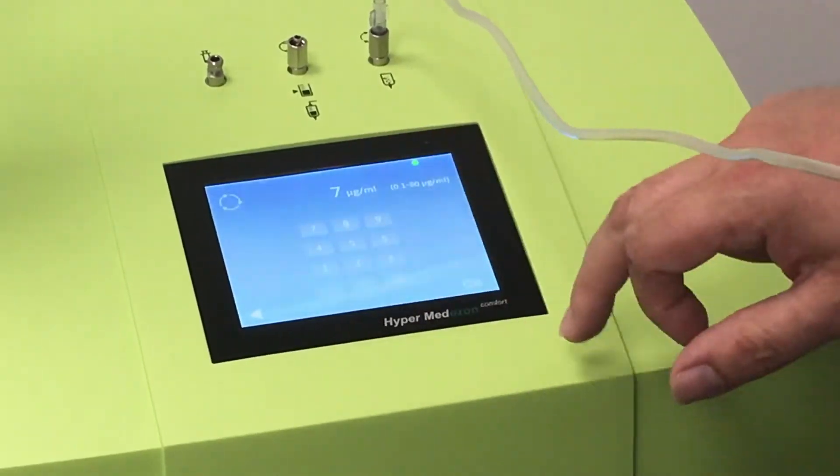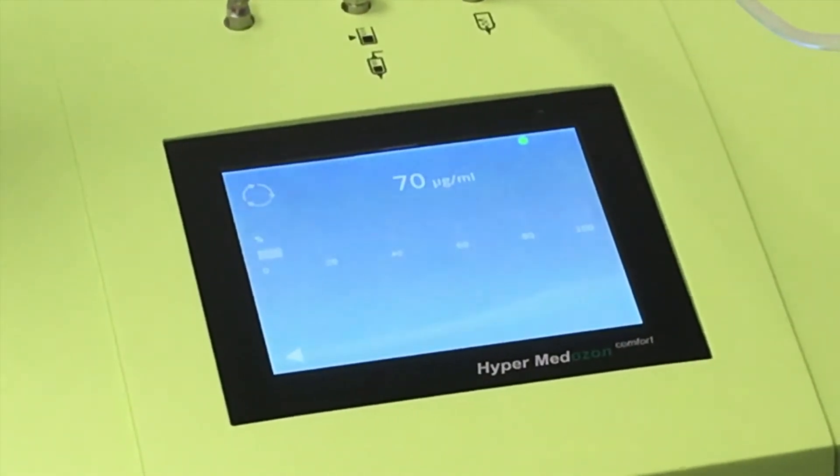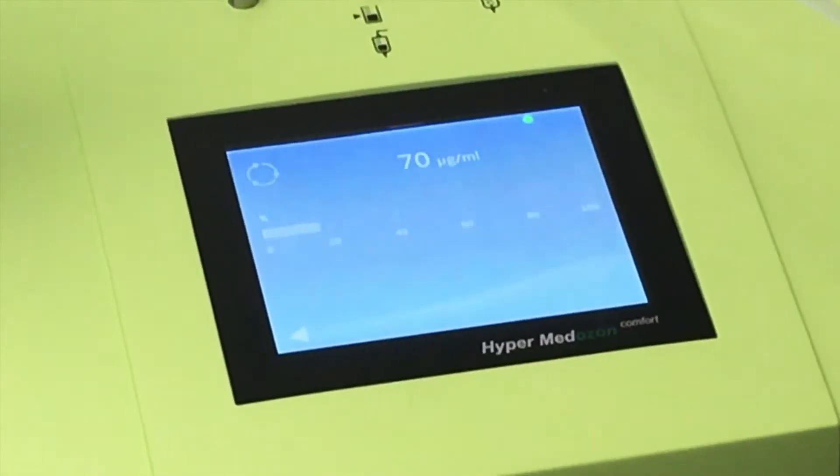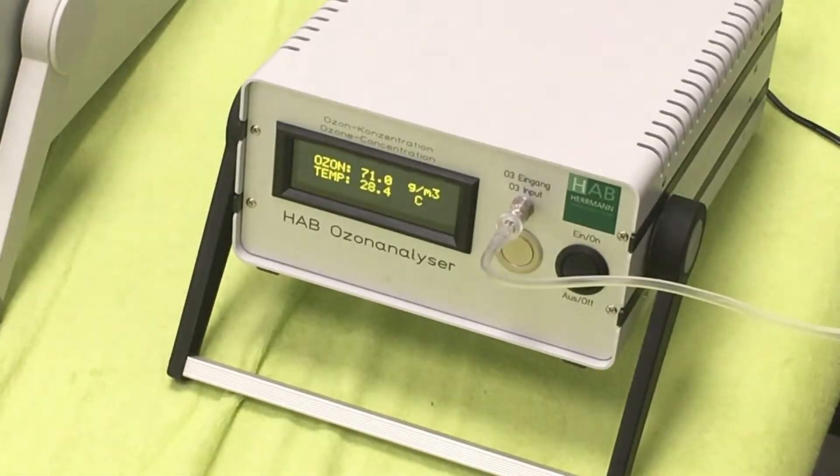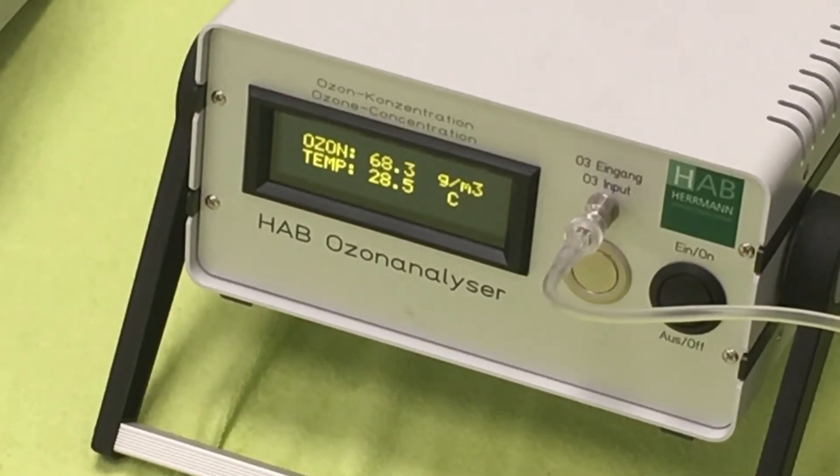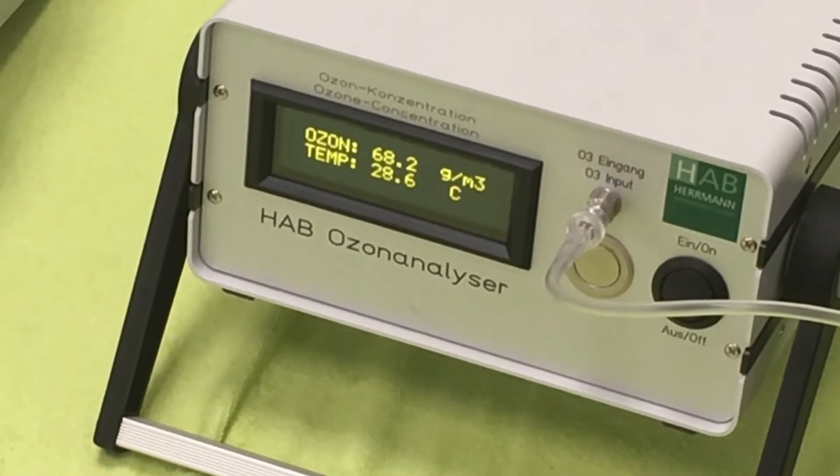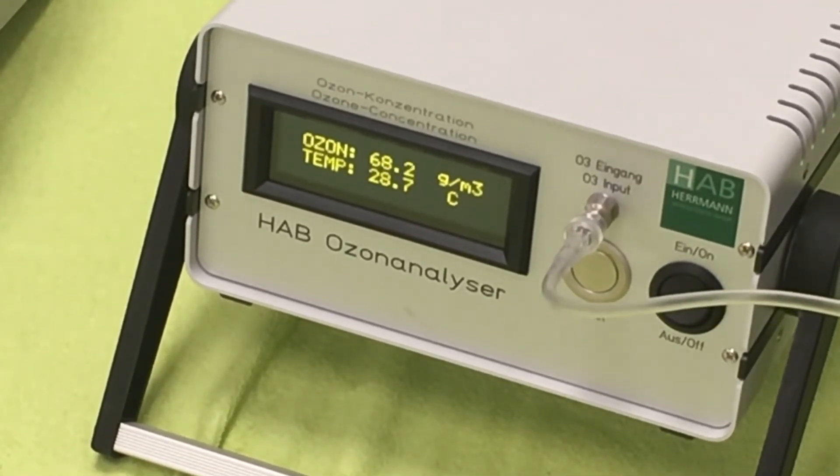At 70 micrograms per milliliter, the machine gave us 68.1, 68, 67.9, 68.5.